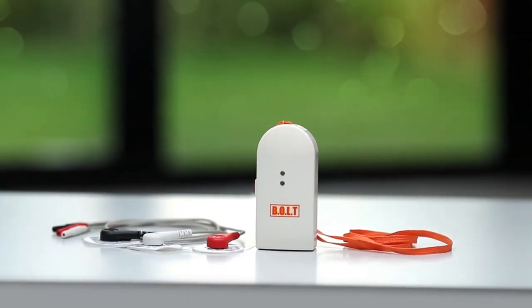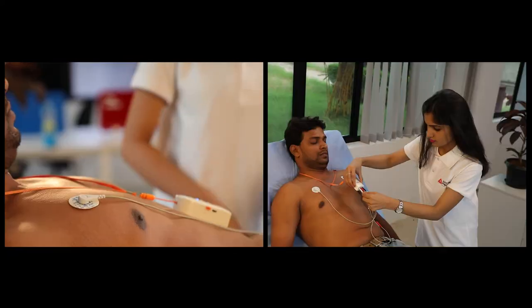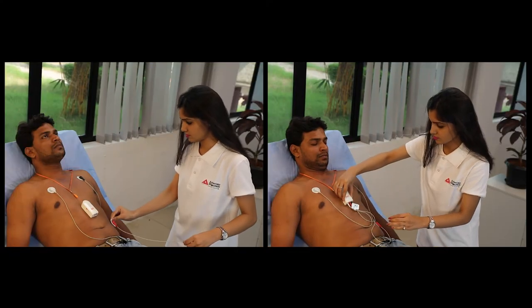The wireless Bolt ECG device is compact and portable, and monitors your heart condition. To check ECG, connect the ECG electrode cables to the connector of the device.